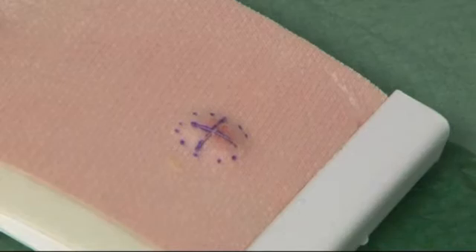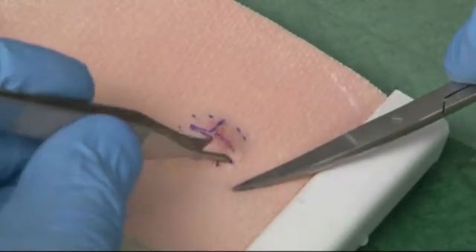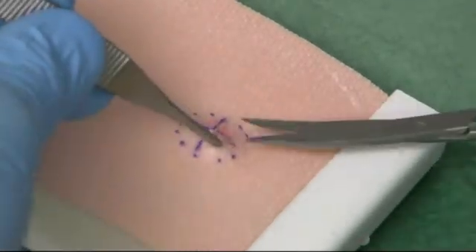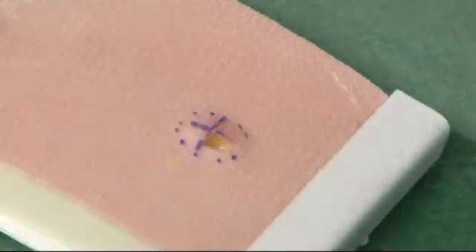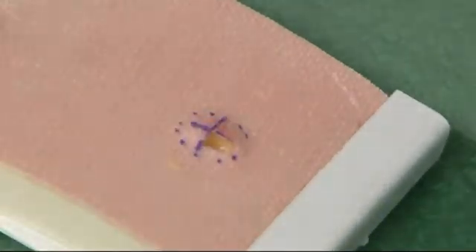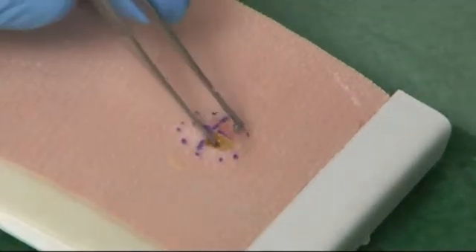If needed, gently excise the corners of the cruciate incision, as these will probably be dead and it would also facilitate further drainage of the abscess.